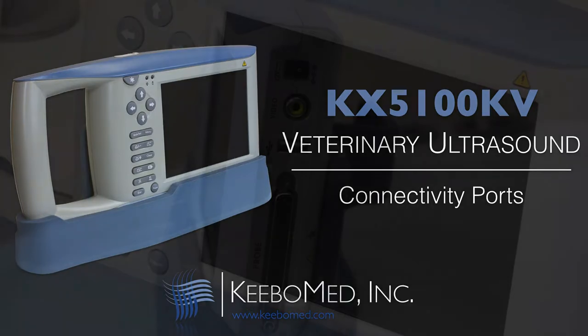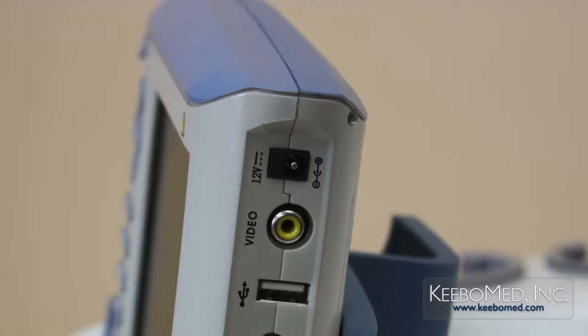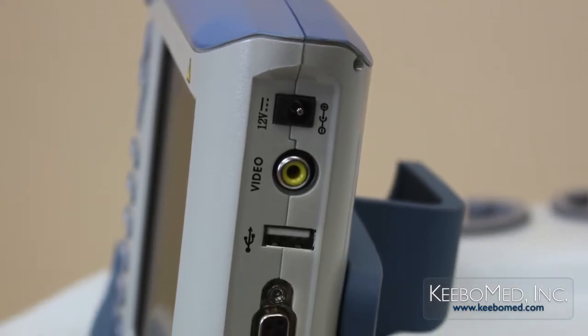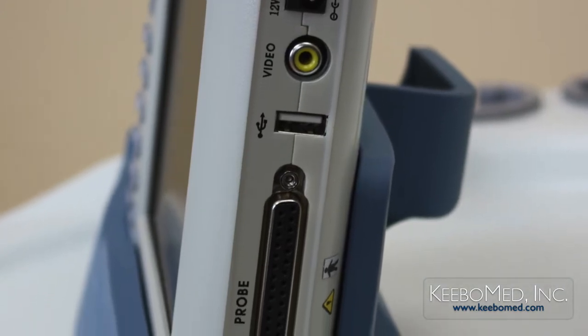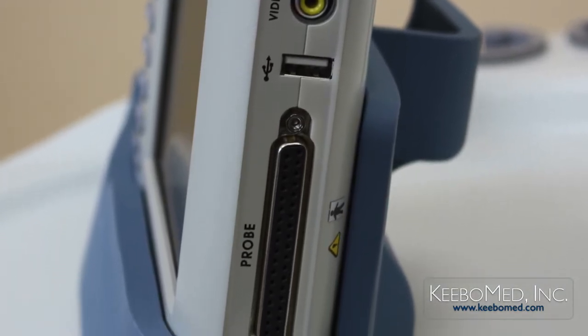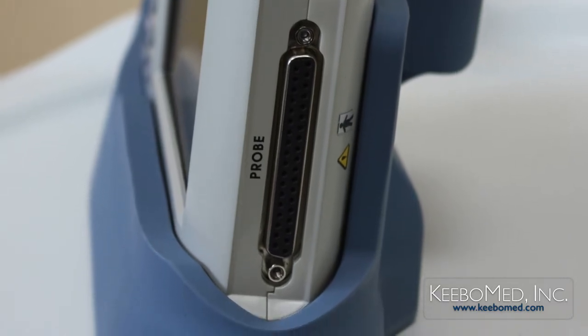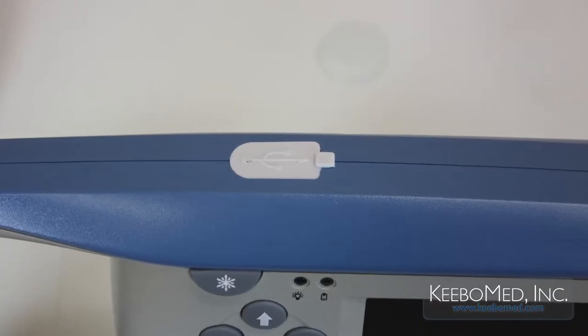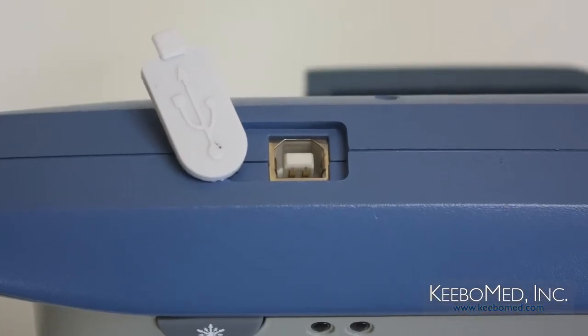On the side of the ultrasound are four different ports: a DC power input port, a video signal port, a USB port that will support a USB drive to save and transport images, and one probe socket. On the top of the machine is an additional USB port suitable for direct connection of laser printers.